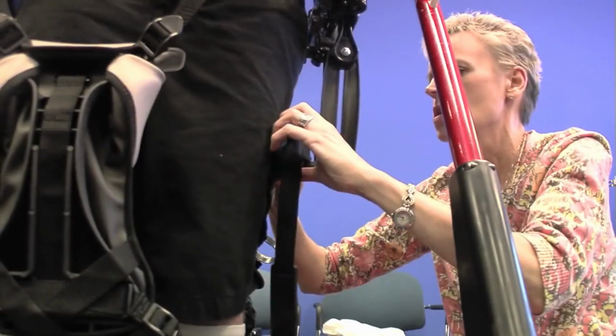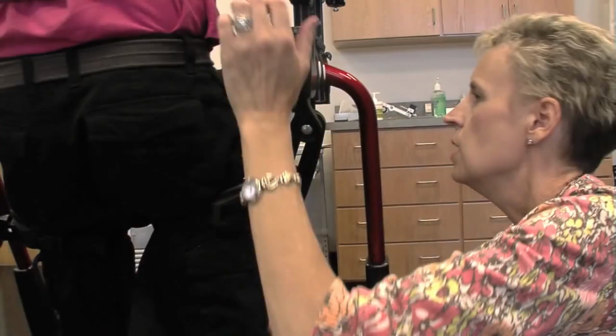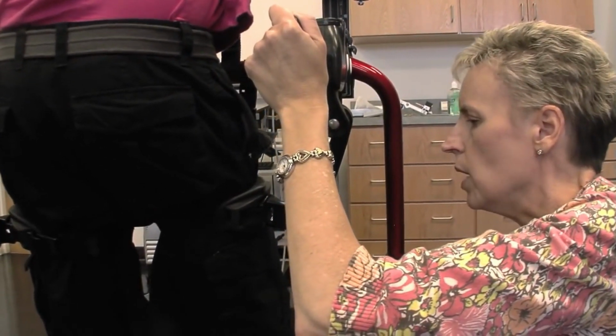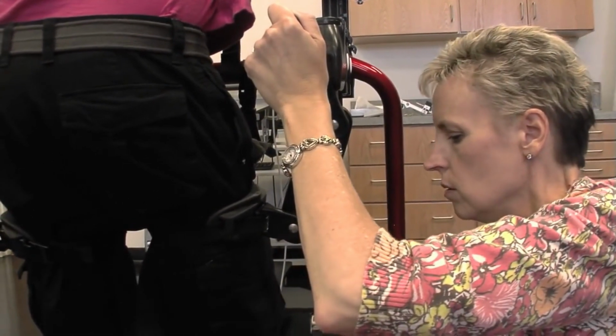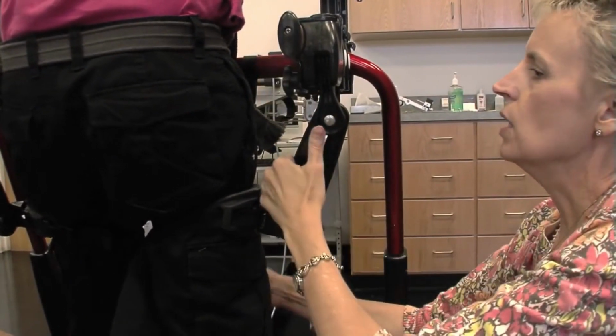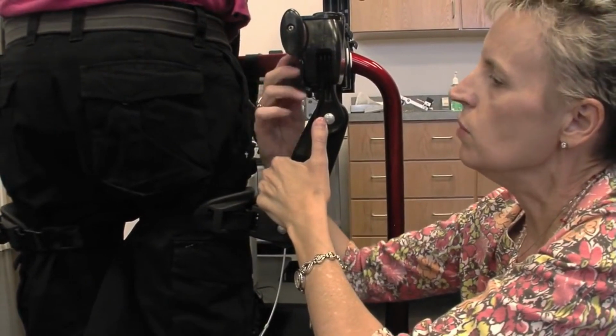Yeah, that's good. Bring this one back to me. Yeah, move your leg back here, big guy. Bring this leg back. Bring your right leg back. There you go, perfect. Now stand up really straight. So whatever position you really like, then you need to tighten this baby down.